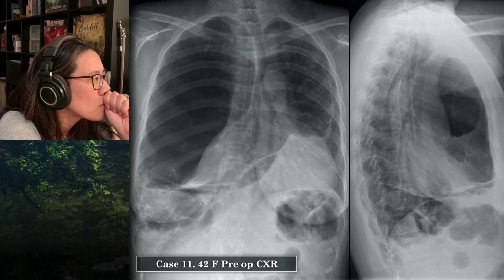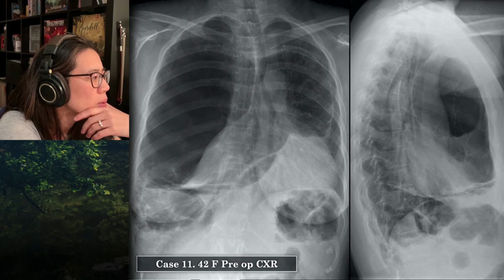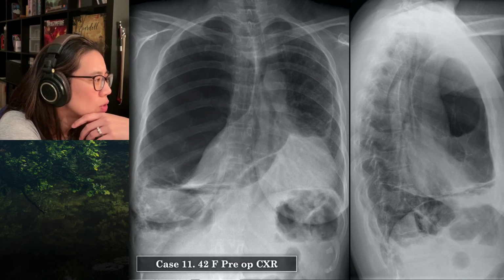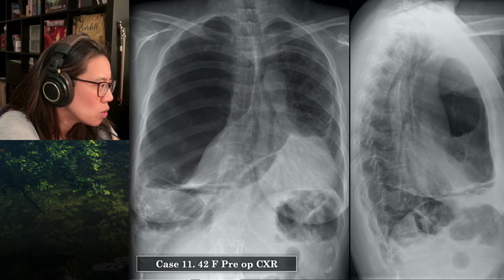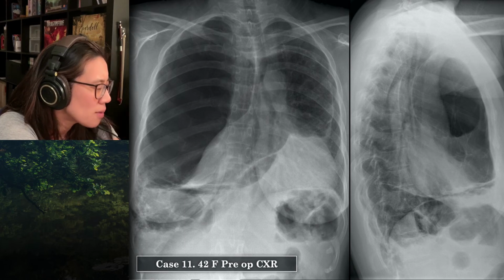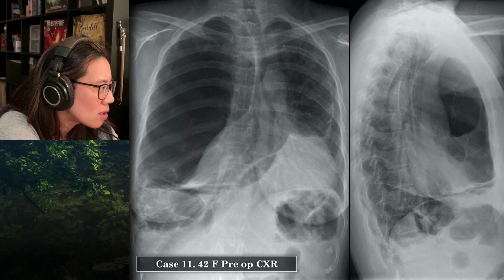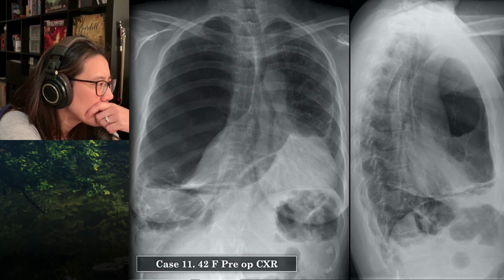How long's it been like that for the anterior junction line to get across there and the heart to get shoved way across? Where's the right heart border? Well, initially I thought it was the edge that's seen along the medial inferior aspect of the right hemithorax, lateral to the, I think the 8th, 9th and 10th vertebrae, sorry. Initially I thought it was that, but now I'm less certain. Now you've spent a bit more time looking, you think it's that structure to the left of the spine. Yep, I do. Which is correct. So the heart is shoved way across to the left of the spine. The anterior junction line's way across near the left hemithorax.